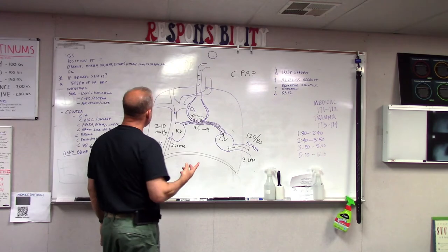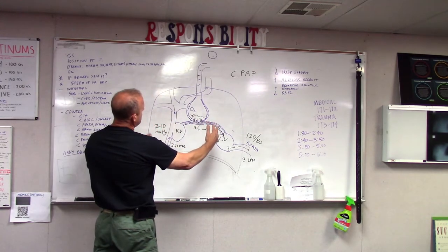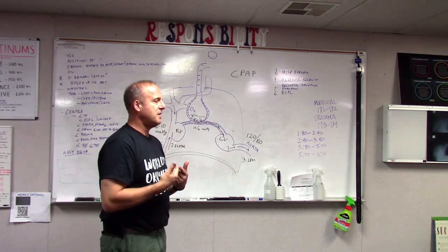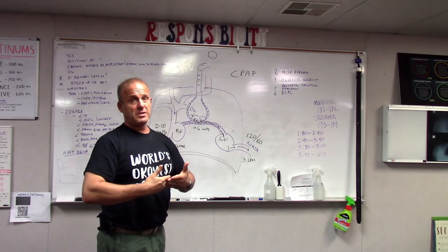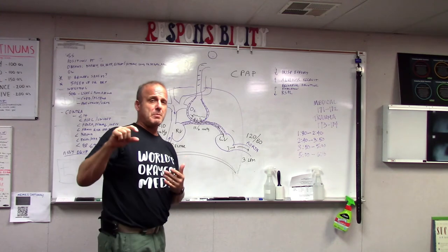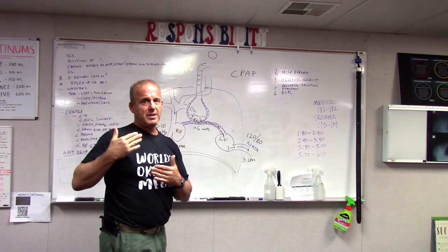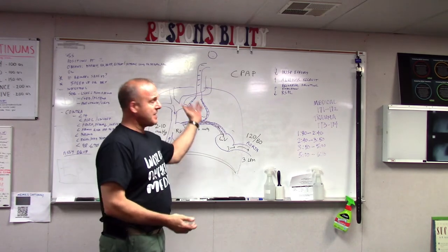But the big magic is that the CPAP will now increase that intrathoracic pressure, because you've gone from negative pressure breathing, which is negative pressure to suck air in, and exhalation, to now adding 5 centimeters, 7 centimeters, 10 centimeters of additional pressure to your inspiration. And keep in mind, normal breathing is only a difference of about 3 or 4 centimeters, a gradient between the lungs and the external air. Like if you just take a negative pressure breath of -5, you get a breath in. CPAP is adding to that.